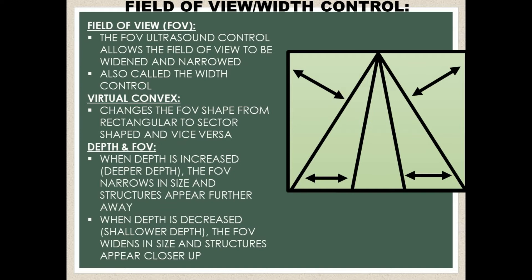It's important to note that depth and field of view go hand in hand — when one changes, the other changes. When depth is increased, meaning there's a deeper depth, the field of view narrows in size and structures appear further away on the ultrasound image. When depth is decreased, this is a shallower depth, the field of view widens in size and structures appear closer up.